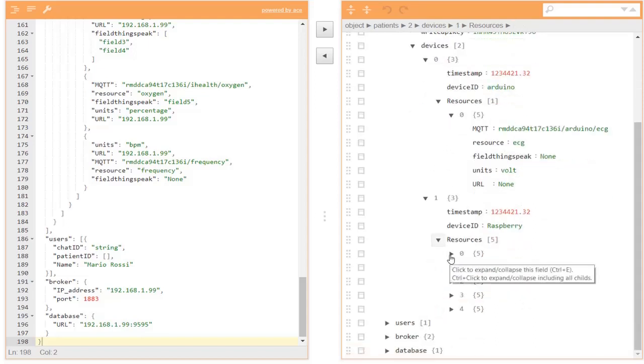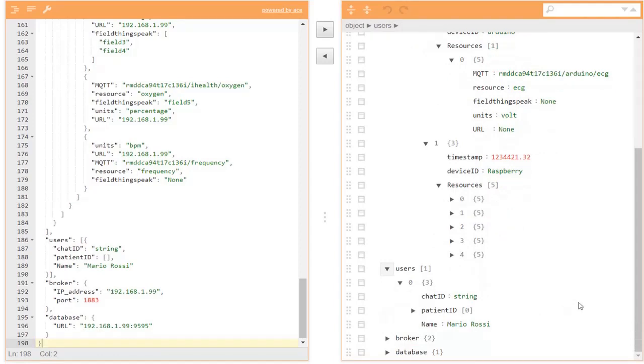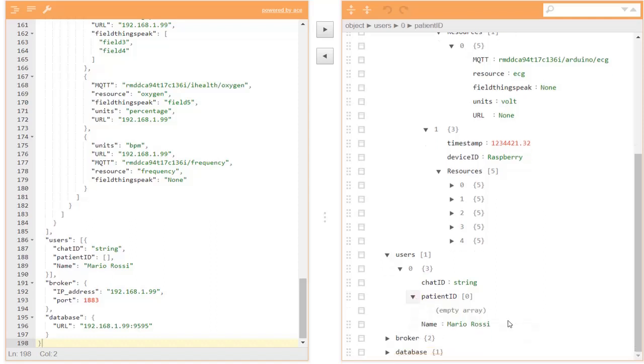Raspberry instead has 5 resources that are temperature, humidity, pressure, oxygen saturation and heart frequency. Users is the list of the doctors connected to the system. We can see that each user has a chat ID and a patient ID. We see that patient ID is an empty array. We will see later, when we explain how Telegram works, that each user will have a chat ID and a list of patients related to him.